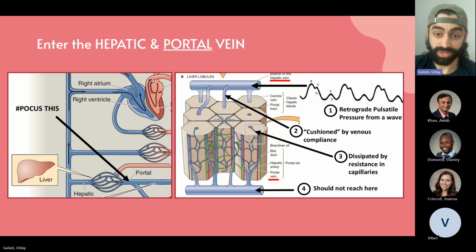The tissue surrounding your liver, all your liver blood vessels, should also create resistance that gets rid of pulsatility. So in no way should you expect to see that in your portal vein unless you have venous congestion. It should be a flat curve, a continuous monophasic curve, right? They should just be straight.